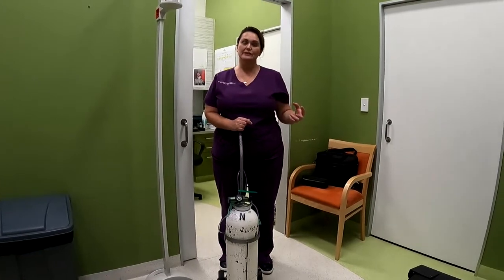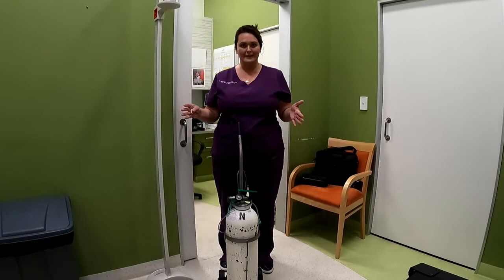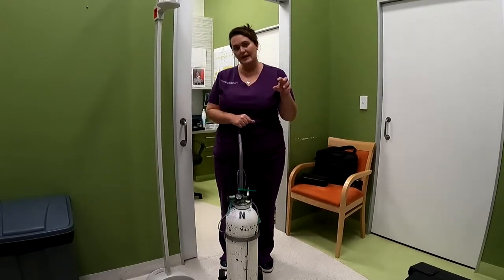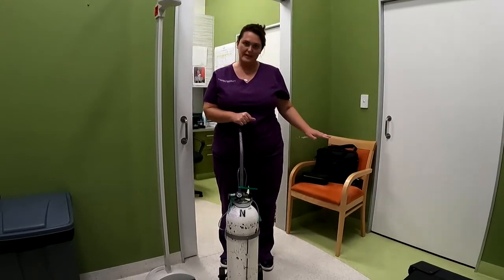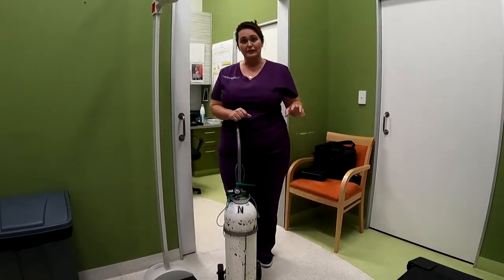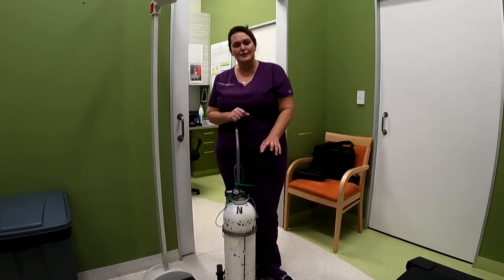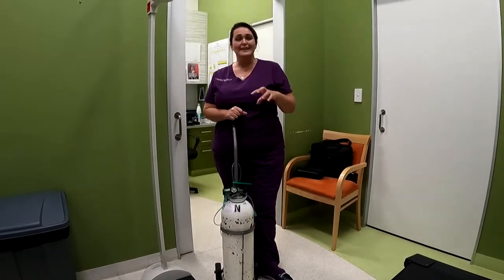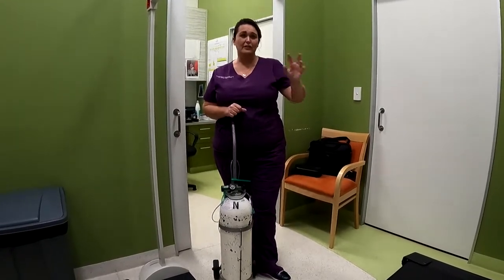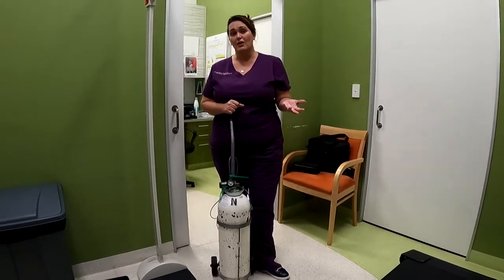They'll show you how to change your regulator from tank to tank. Depending on how many tanks you've got will determine the number of regulators that you've got. Generally, you get one regulator for a big tank and one regulator for your portable tanks. It can sometimes get a bit fiddly changing the regulators over all the time, and as I said, they'll demonstrate to you how to do that. If you want to, you can hire an extra regulator if you get a bit sick of changing it over constantly. They're about $38 a month to hire.